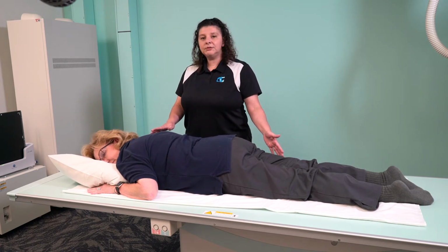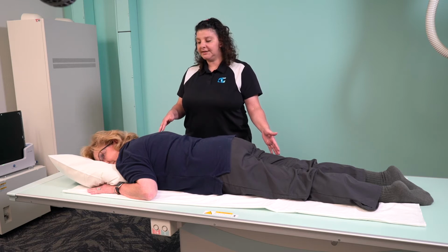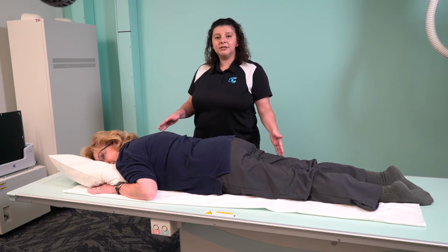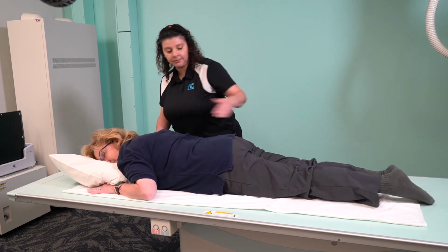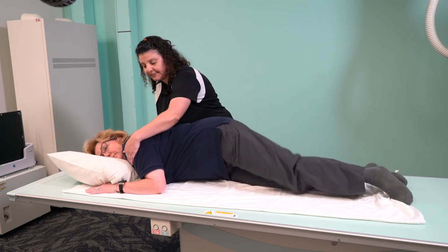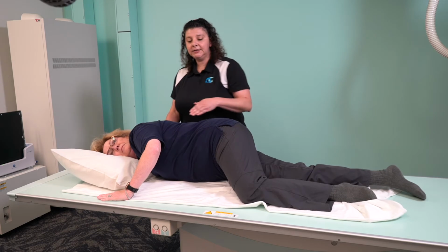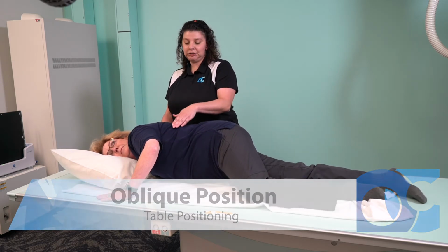We can also do oblique positions. An oblique position is when the patient is neither flat on their stomach nor flat on their back. The mid-coronal plane is not parallel, the mid-sagittal plane is not perpendicular, it's in between. So if I want her in an oblique position, I'm going to roll her up a little bit towards either right or left. Let's get her this way. See how now the mid-sagittal plane is neither perpendicular and the mid-coronal plane is neither parallel? This is an oblique position.